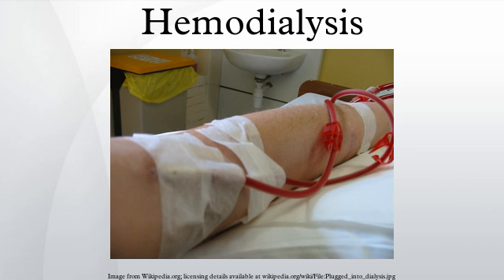By the 1950s, Willem Kolff's invention of the dialyzer was used for acute renal failure, but it was not seen as a viable treatment for patients with stage 5 chronic kidney disease. At the time, doctors believed it was impossible for patients to have dialysis indefinitely for 2 reasons. First, they thought no man-made device could replace the function of kidneys over the long term. In addition, a patient undergoing dialysis suffered from damaged veins and arteries, so that after several treatments, it became difficult to find a vessel to access the patient's blood.